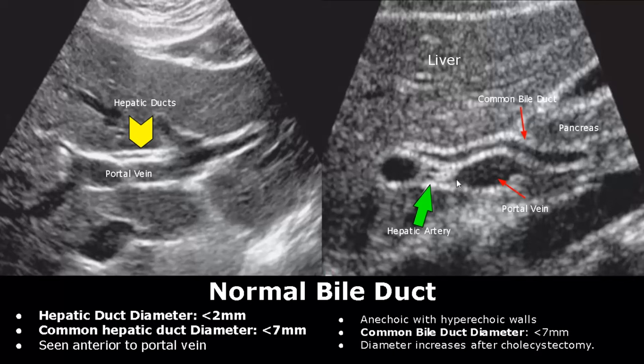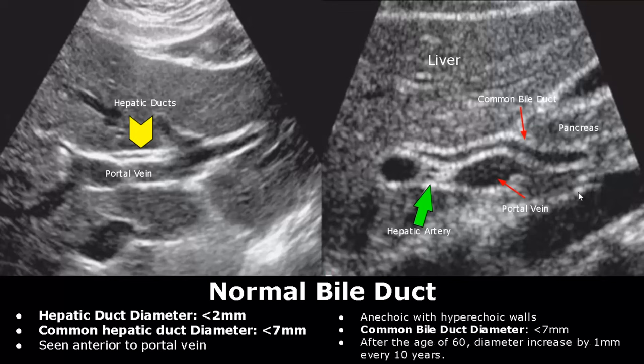We see the hepatic artery in cross section here. After a cholecystectomy — that is, gallbladder removal — the diameter will increase. After the age of 60, the diameter starts to increase by one millimeter every ten years.